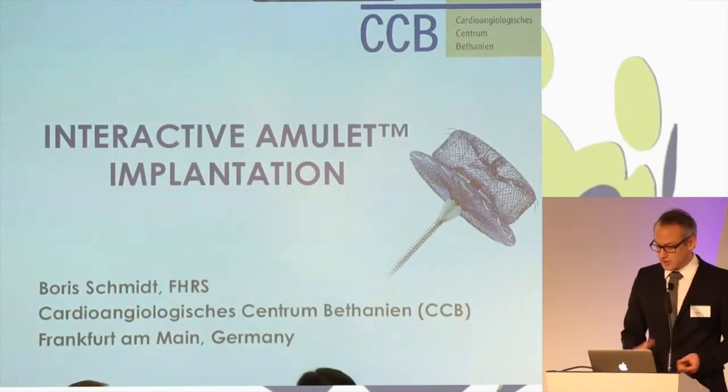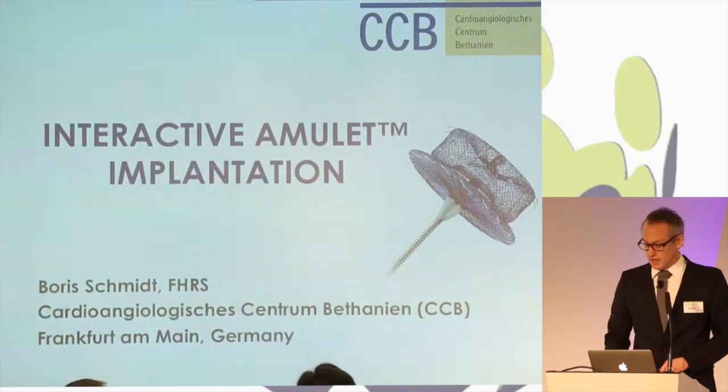That is your chance to participate, or at least to focus your attention on my presentation. We probably cannot change our work due to your votings, but at least we have a basis for discussion. So the title of the talk is Interactive Amulet Implantation.